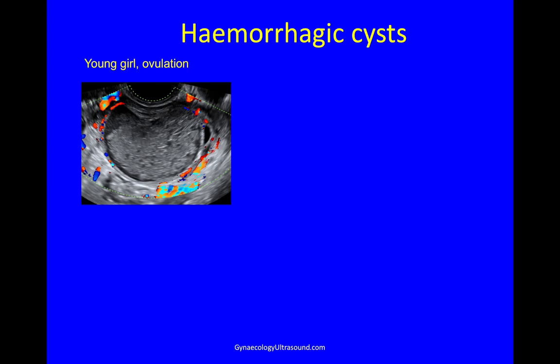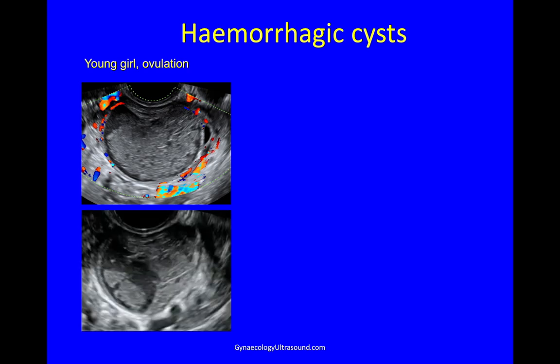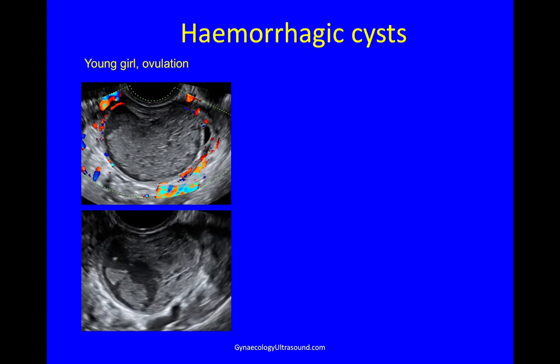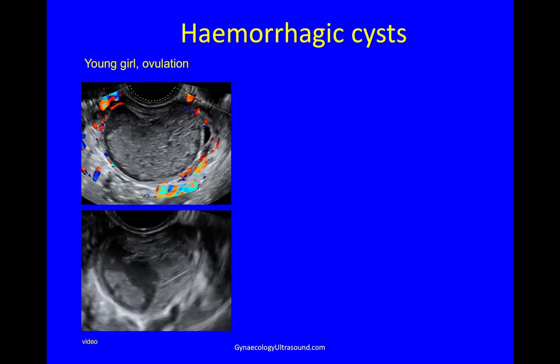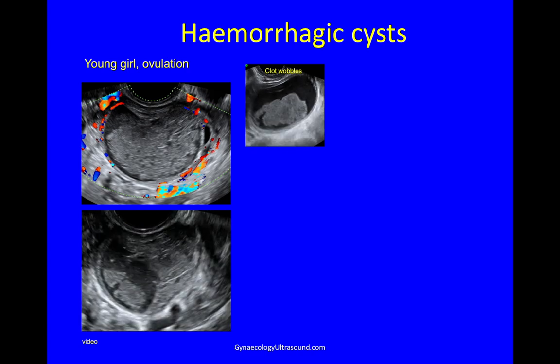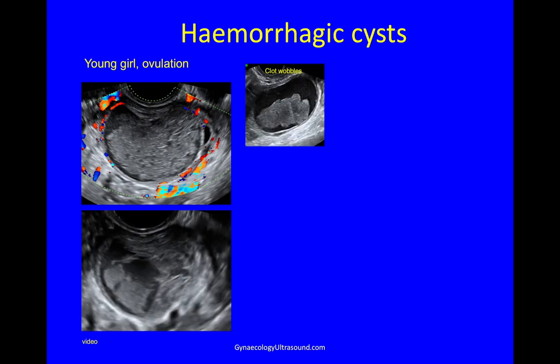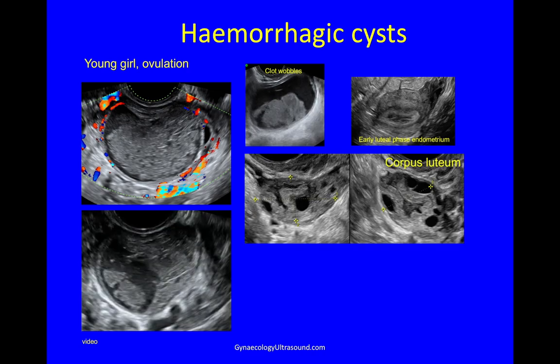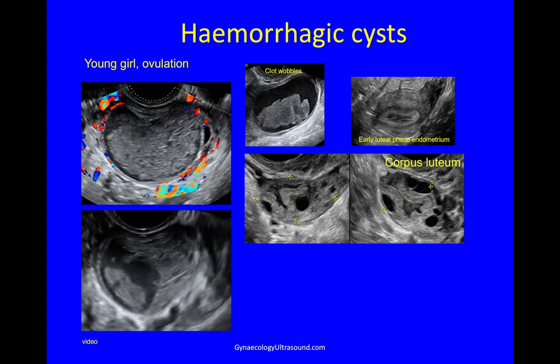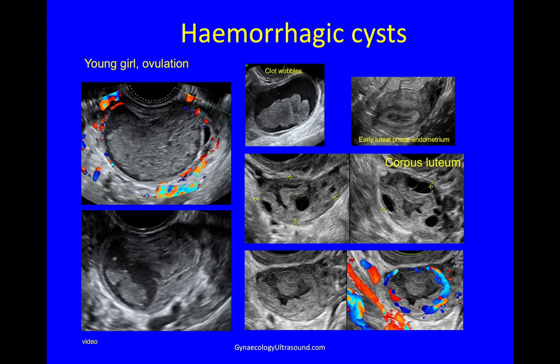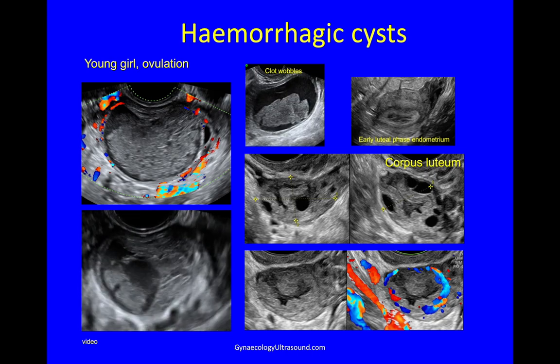This girl had just ovulated and came in with severe pelvic pain. With very gentle pressure you can see that the clot wobbles — a typical feature of hemorrhagic cysts when they have clot inside them. Look for early luteal phase endometrium and in other cases look for a corpus luteum as a collapsed crenelated mass with a strong ring of fire vascularity on colour Doppler.